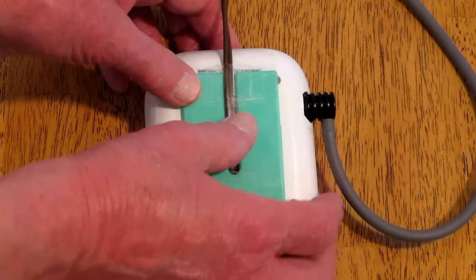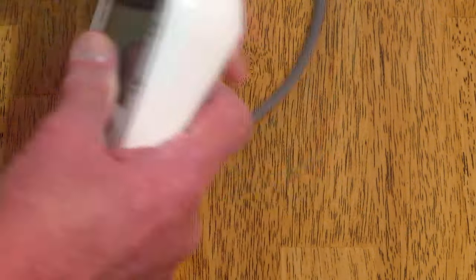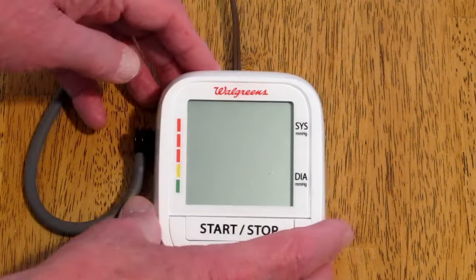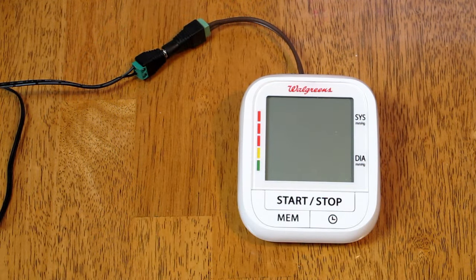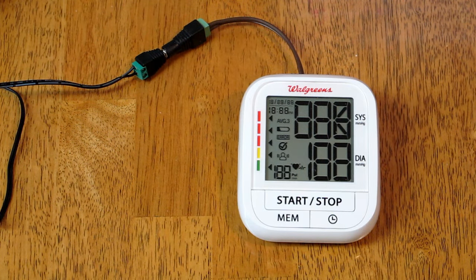This is taped in place to hold the wire down. It generally sits on the desk or table and doesn't need to move around. And does it work? Yes it does.